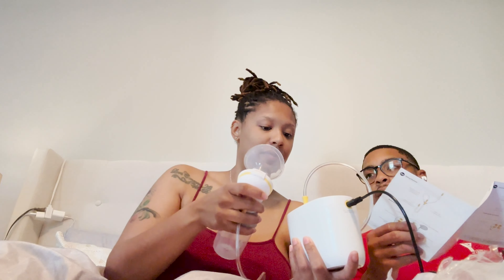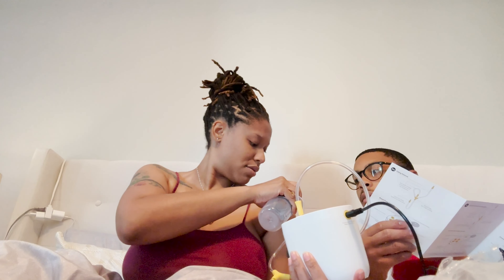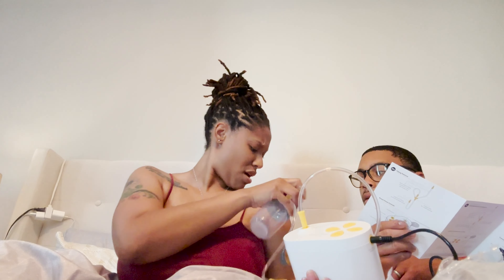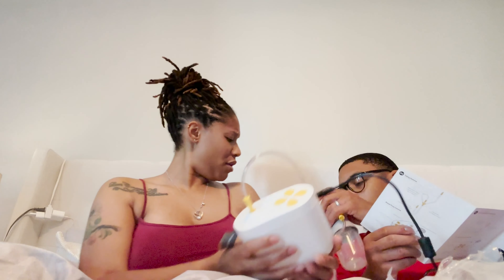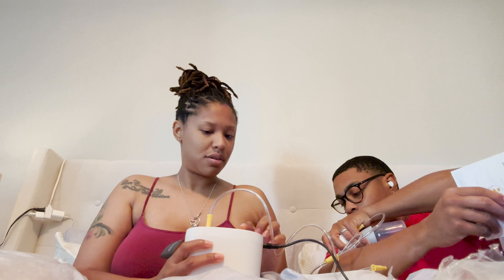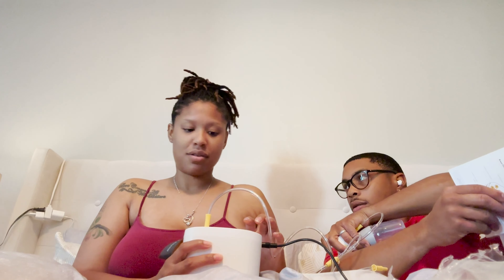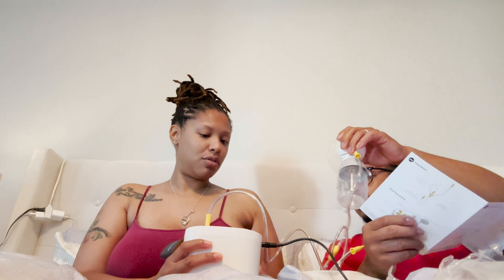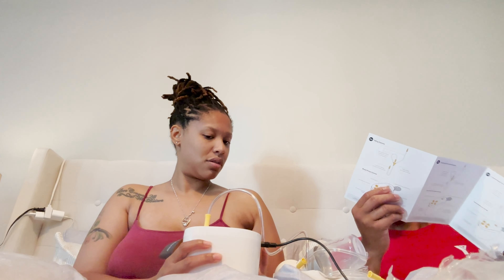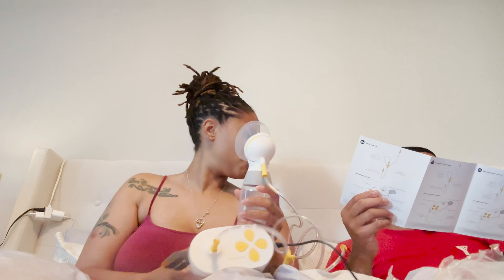You gotta give it some suction too. Put it on your arm — do you feel it? Oh, it only has two settings — yeah, it's like two different modes, just two. Did you feel it? Yeah.